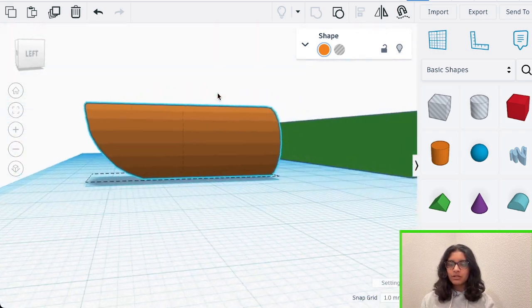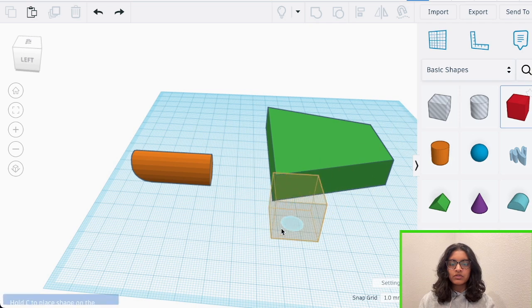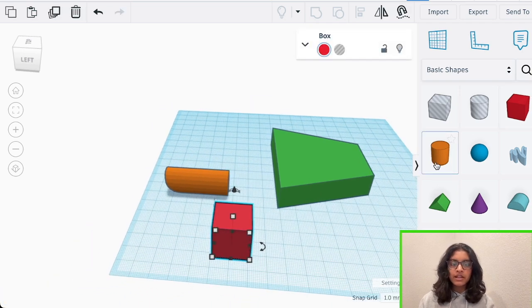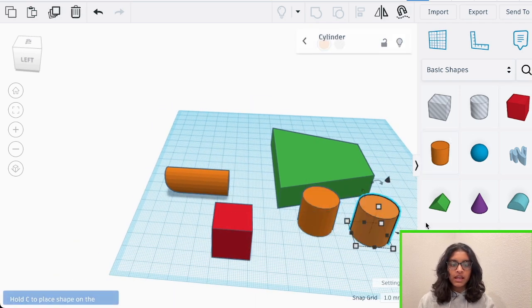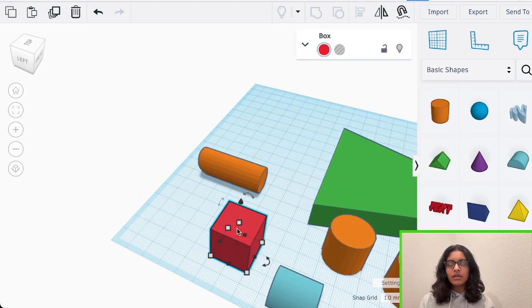Now our finger shape should be looking pretty natural and done. To make the fingernail, it's pretty simple. We're just going to drag and drop a box to the work plane, two cylinders, and a semicircular shape. Now again, we're going to be giving this cubicle shape very specific dimensions for our fingernail for this base project, but if you'd like to make it a bit thicker, a bit taller, just feel free to change these dimensions.